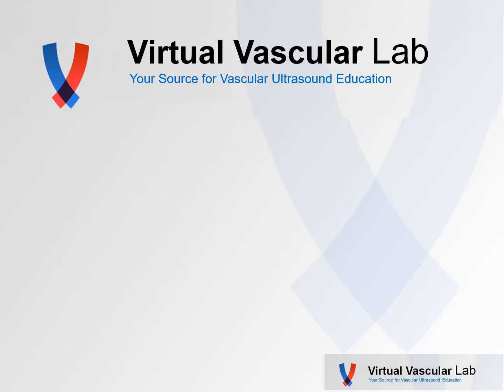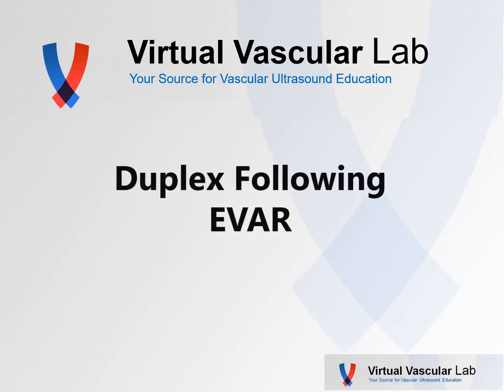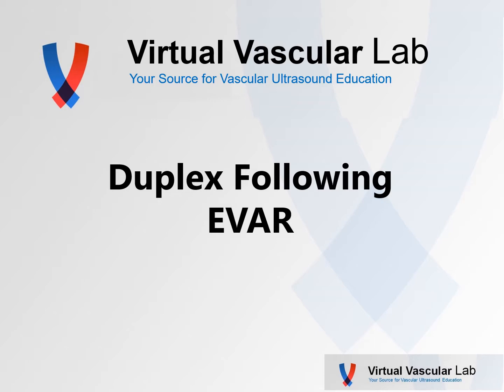Let's talk about duplex evaluation following an endovascular aneurysm repair. Hope you enjoy.